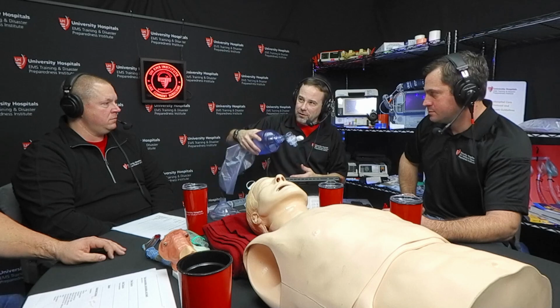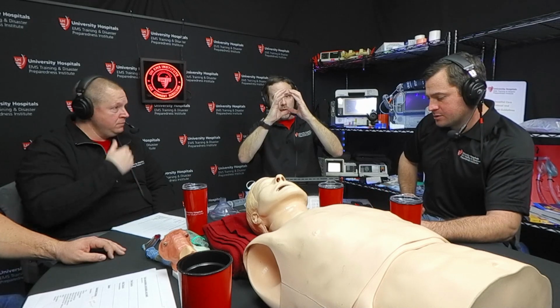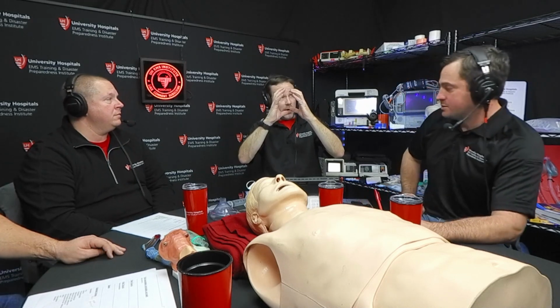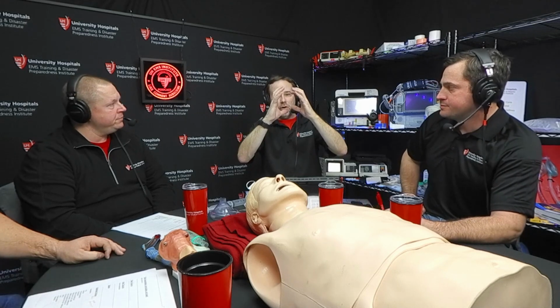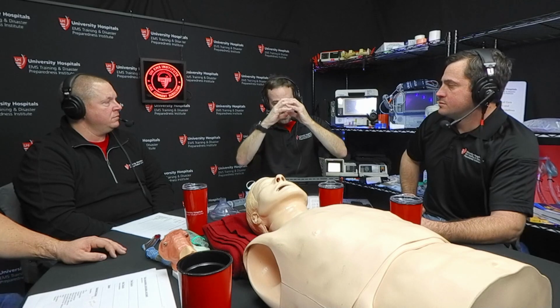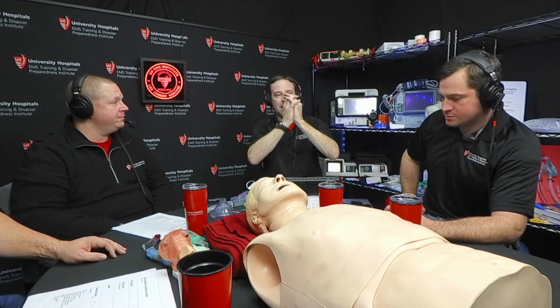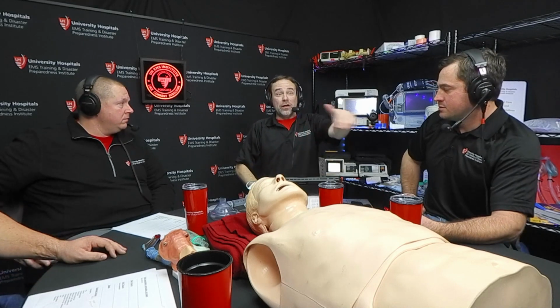And if you strip that vent for any reason and then go to just a bag valve mask, you don't have that end-expiratory pressure keeping the alveoli popped open. The word literally means positive end-expiratory pressure. The alveoli collapse back down, and it takes progressively more pressure every time you don't leave them expanded to unglue them and pop them back open, if you haven't already gone into atelectasis at that point. That would be a reason that we may add it to begin with.